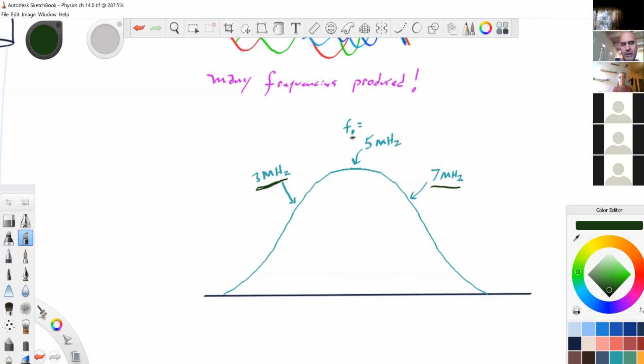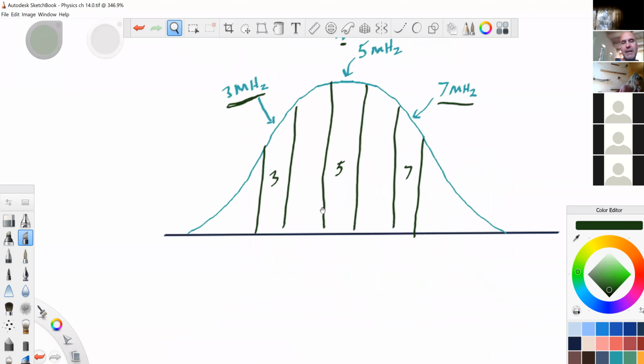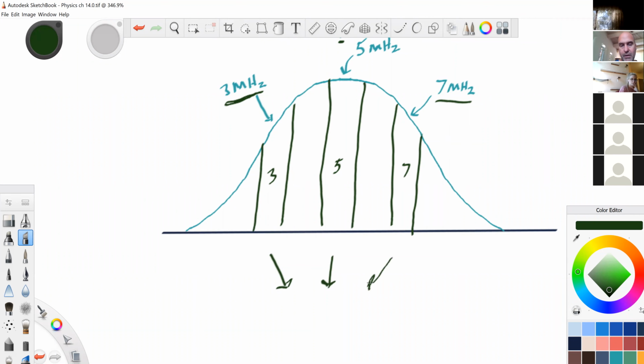Dynamic frequency tuning could say, well, I'm going to create a picture out of the 3. And then I'll create another picture out of 5, which is what I'm supposed to be doing in the first place. And I'll create a third picture out of the 7. I'm going to make these pictures, at least in the background, electronically speaking, I'm going to make these 3 separate. And then I'm going to add them all together to create one image.